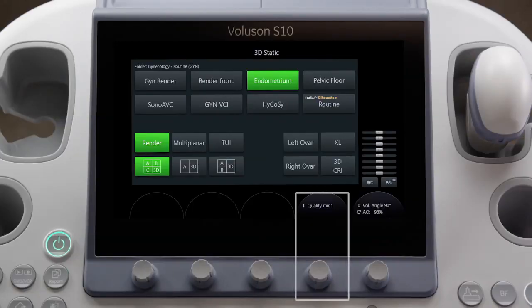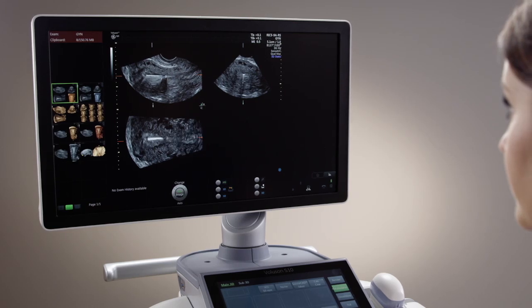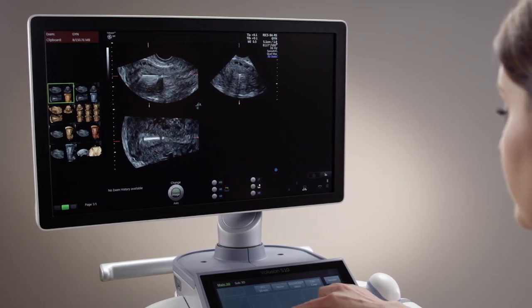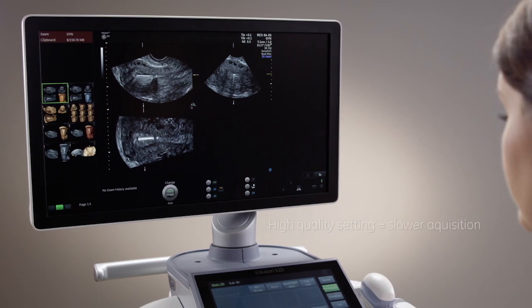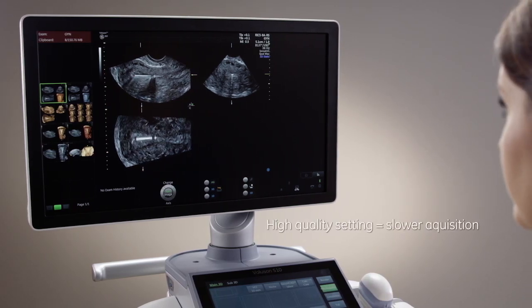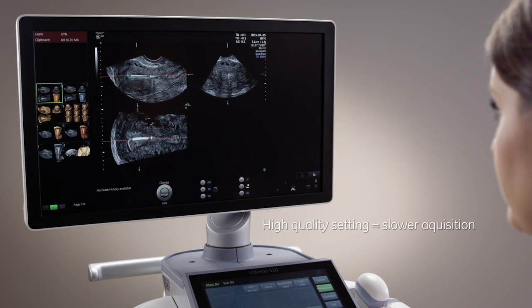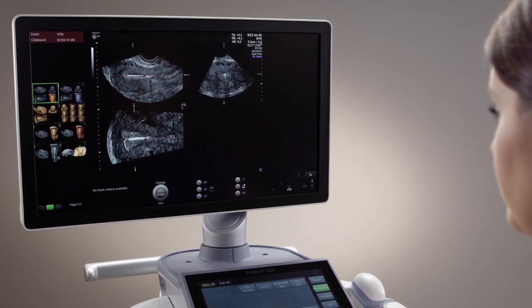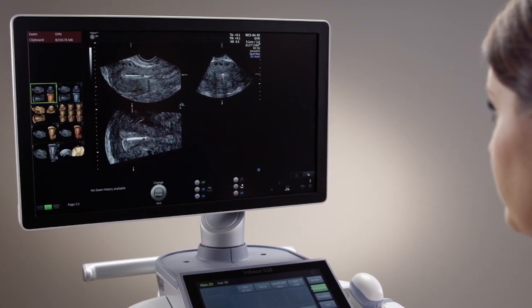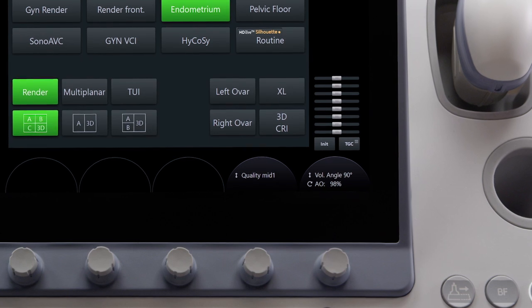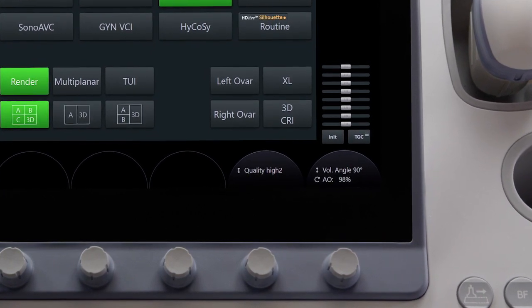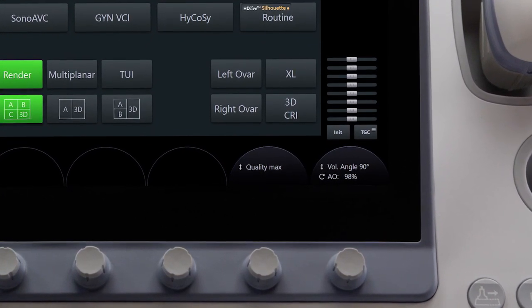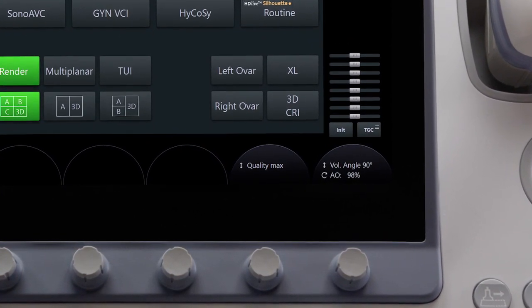The resolution of the volume is controlled by the quality setting. As in 2D, most IQ enhancement settings are a trade-off with frame rate. The higher the quality setting, the slower the acquisition will be, thus collecting more information in the volume and increasing resolution. Use the highest settings to achieve good resolution. Once these parameters are set, you are ready to acquire your volume.